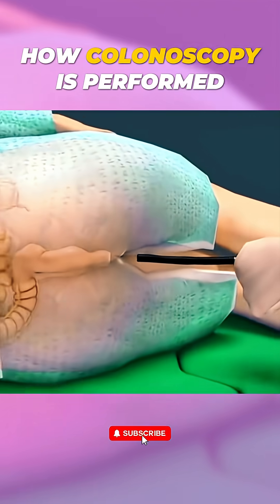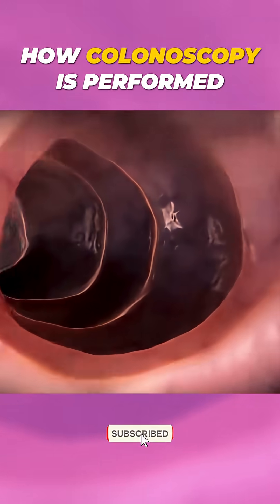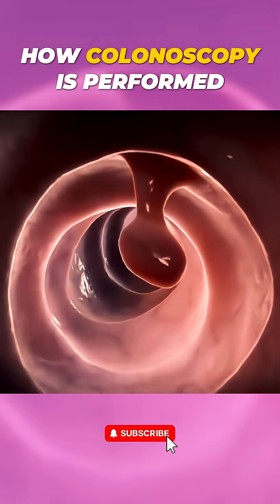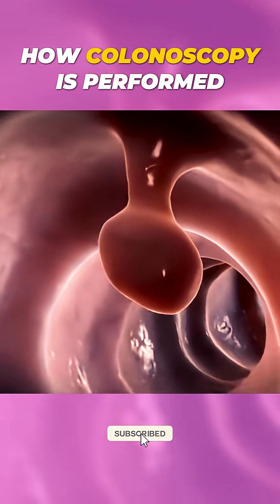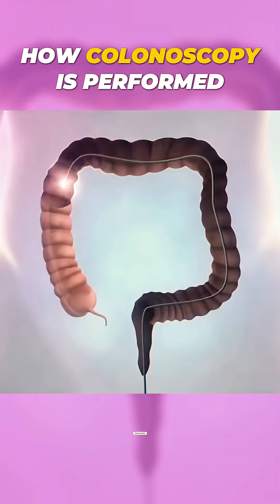Ever wondered how doctors check inside your colon? Let's take a look at how colonoscopy is performed. A colonoscopy is a procedure where doctors use a flexible tube with a tiny camera called a colonoscope to examine the lining of your colon and rectum.